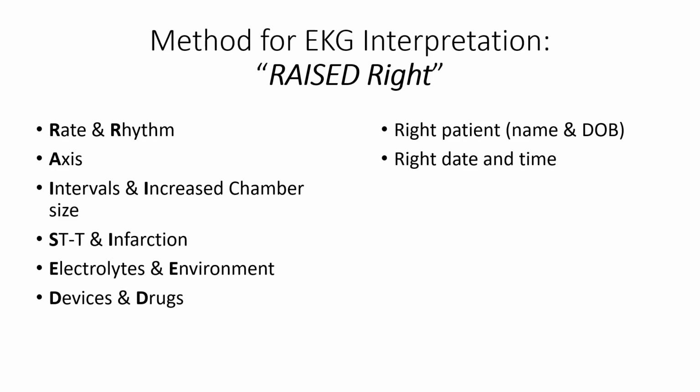Also, the correct date and time at which you interpret the EKG. If you do an EKG at 8 o'clock in the morning and another one at 8:30, you want to be able to compare the two and assess for any differences. Next is going to be the right hookup.